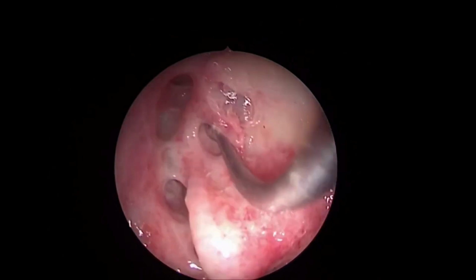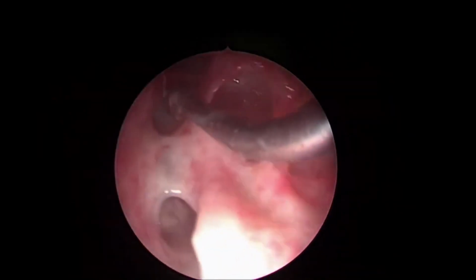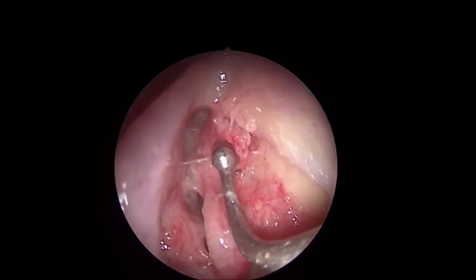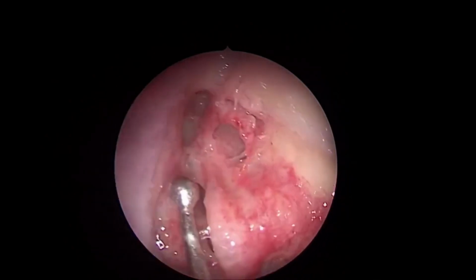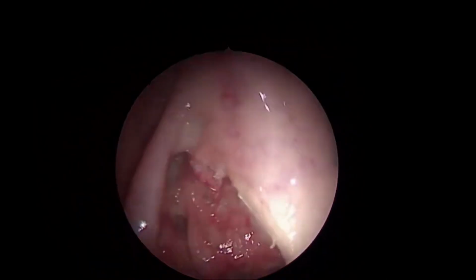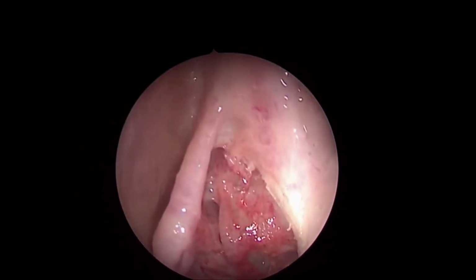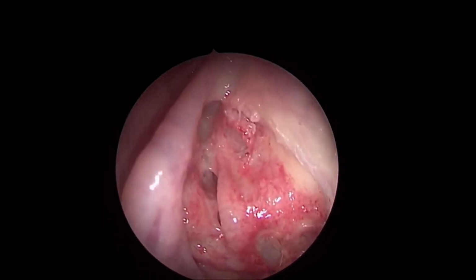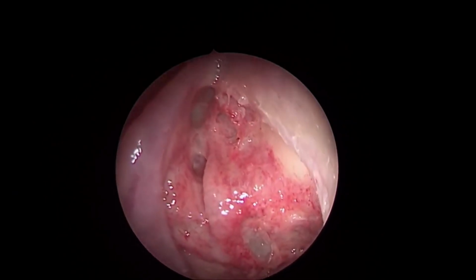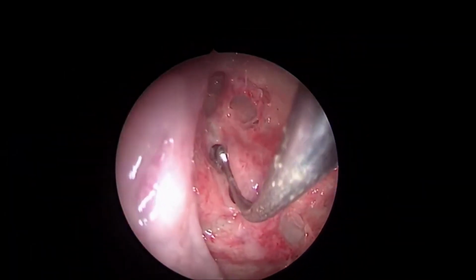This is one. Secondly, we all know this middle turbinate goes up. See this, how it goes up to insert onto the cribriform plate. As long as we stay lateral to the middle turbinate, there is no fear of damaging the skull base. So again, see why this 70 degree is keeping both the medial and lateral limit in view. Lateral limit is the orbit; if I don't cross laterally, I have no fear of injuring the orbit. If I don't cross it medially, I have no fear of injuring the skull base. So that is fear number 2, you can avoid using the 70 degree as you go up.